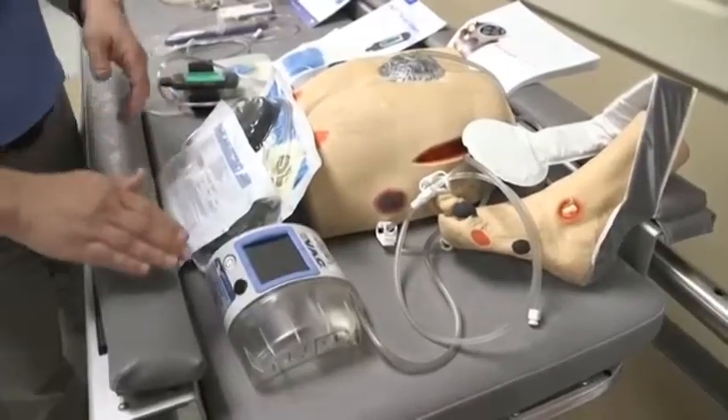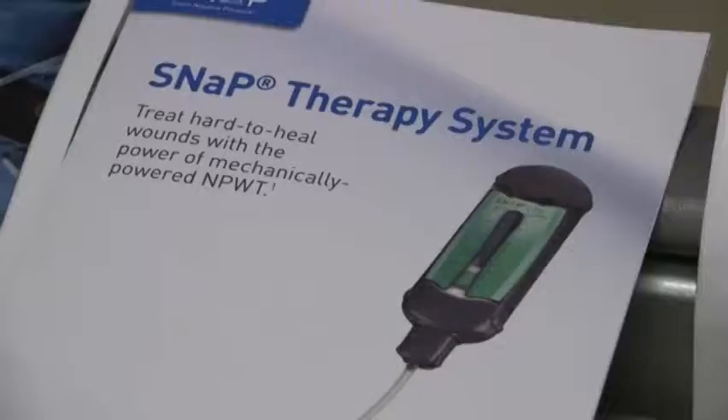Typically, patients wear the device for six to eight weeks. Three days a week, health experts change the dressing.